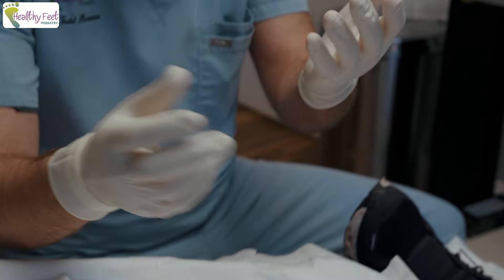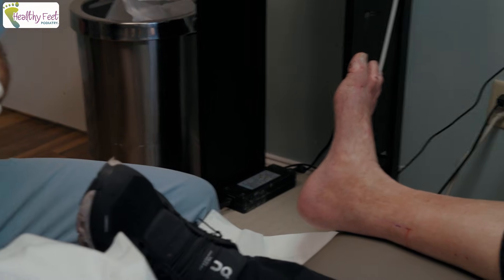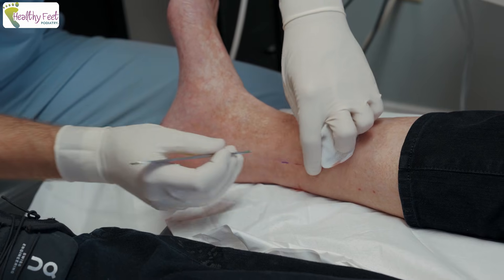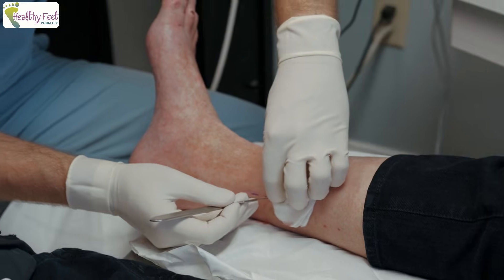You can see the electrodes on the lead here. We can do it in-office — it's a little local block — and it's done based on feel, but we'll also get some X-rays as we go. Do you feel anything sharp? No.